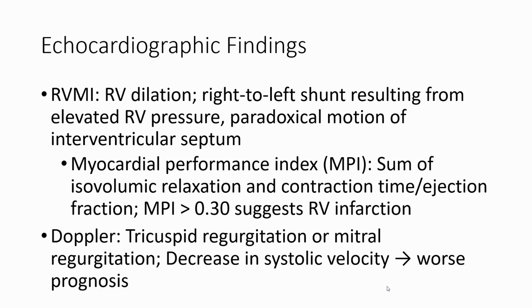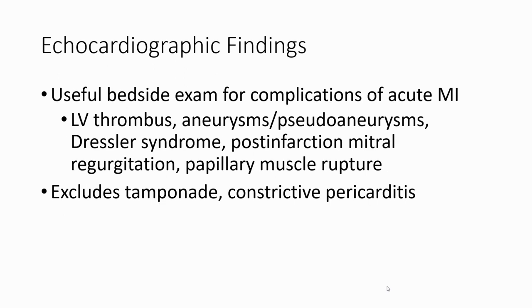Doppler: tricuspid regurgitation or mitral regurgitation, decrease in systolic velocity, worse prognosis. Useful bedside exam for complications of acute MI, to exclude tamponade and constrictive pericarditis.